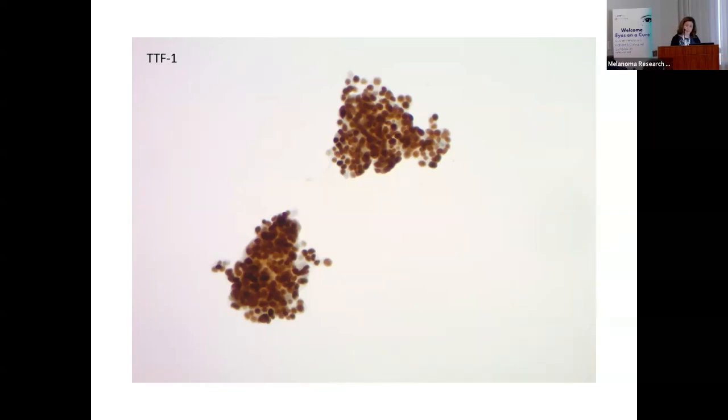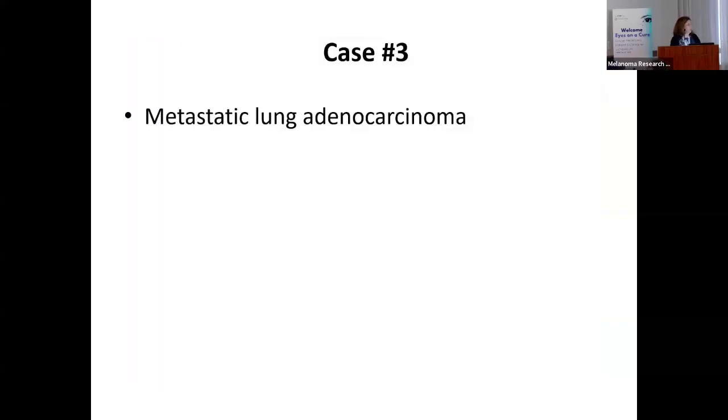And it's importantly absent in melanoma. So if this was a melanoma, this would be completely blank. So this is a lung cancer. This was not a melanoma. And that just shows you that sometimes these cases are very challenging, right? You need to be at a place that can hopefully separate the two, because this patient did not know he had a lung tumor until this eye sample was received.